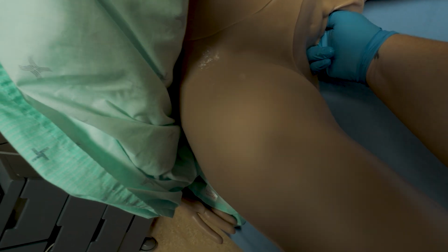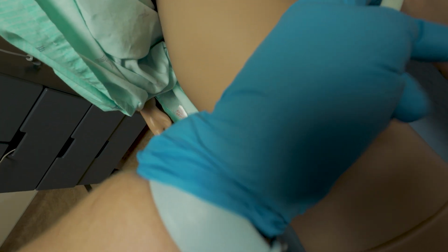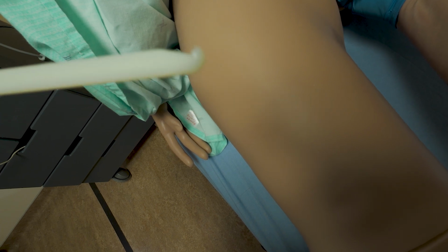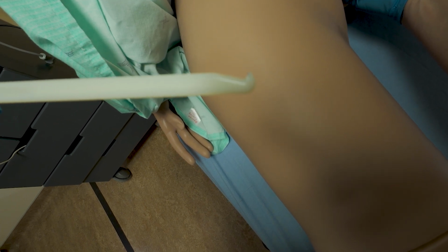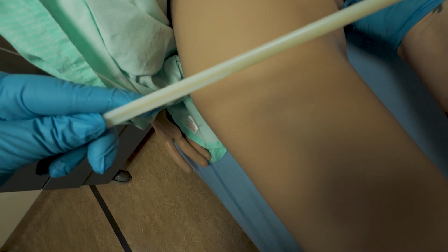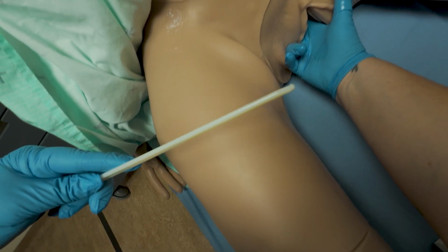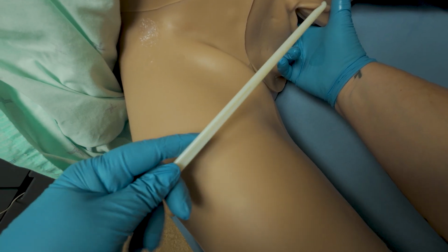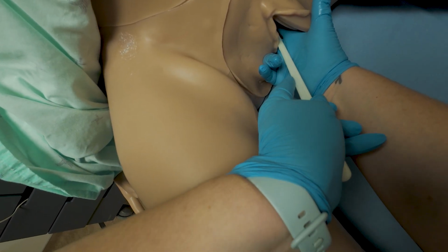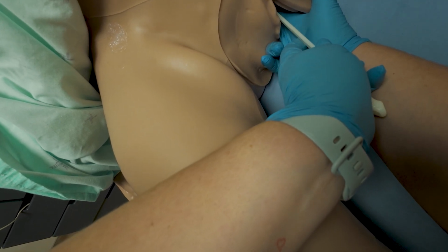So I have my assistant hand me my amni hook in a sterile fashion. It's important to remember that this is sharp. The end of this is quite sharp, so you can see how sharp it is. It's like a big crochet hook. So when you introduce it into the vagina, you want to make sure that you don't scratch your client's vagina with it. You turn it to the side and then slide it between your index finger and your middle finger.